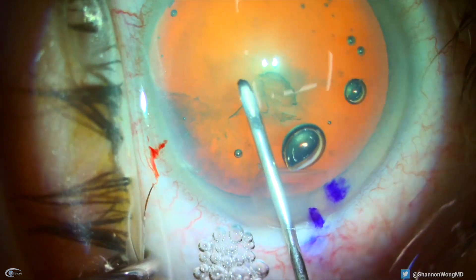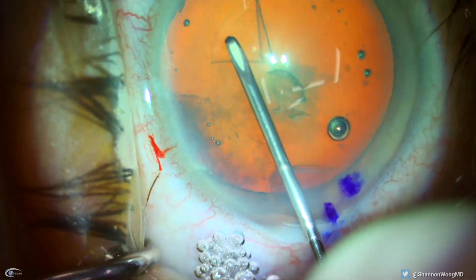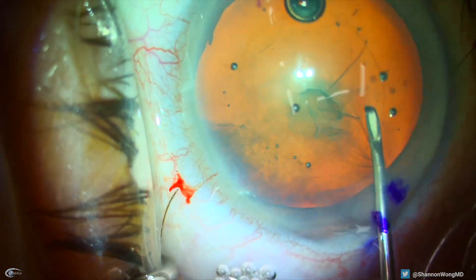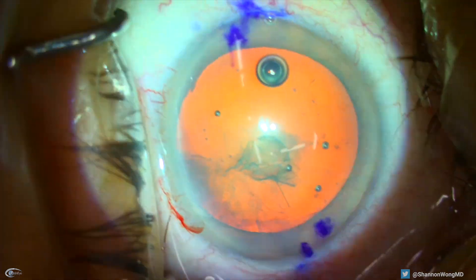Whenever I have a complication, I download the video to replay it. When I replayed this video, I learned something that I did not realize until I actually watched the video. This patient's surgery had gone well up to this point.